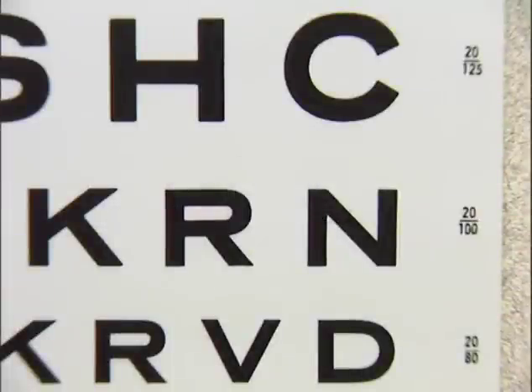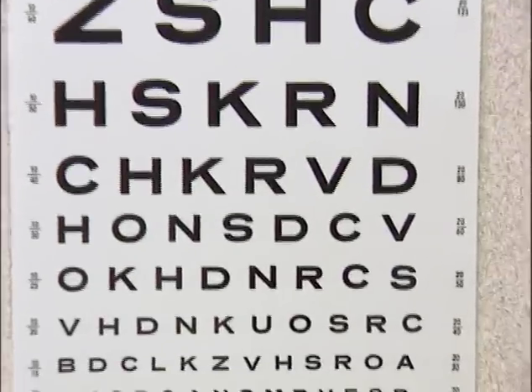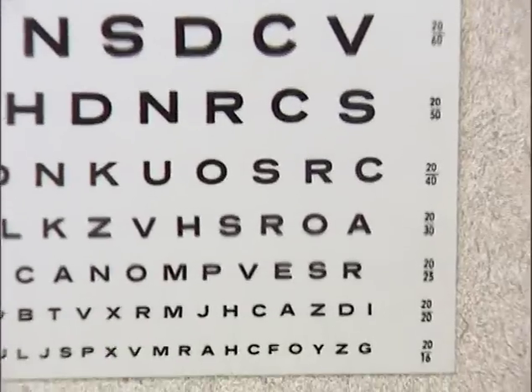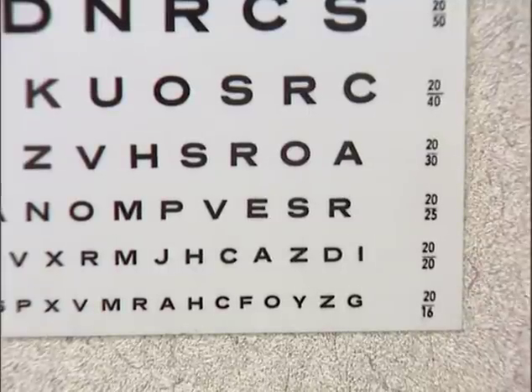For example, if the smallest letters a patient can read correctly are on the 20-100 line, the patient is able to read at 20 feet what the normal eye can read at 100 feet, and the visual acuity is recorded as 20-100. If the patient can read the letters on the 20-20 line at 20 feet, that means the patient's visual acuity is equivalent to that of a normal eye. Some patients are able to read even smaller letters at 20 feet. In such a case, their visual acuity might be recorded as 20/15 or even 20/10.